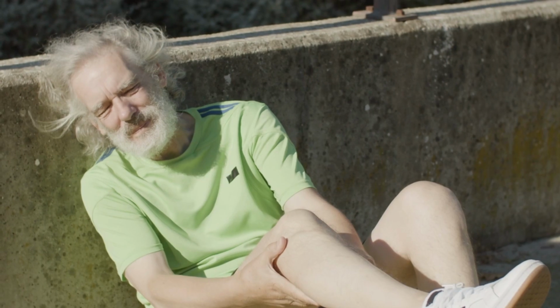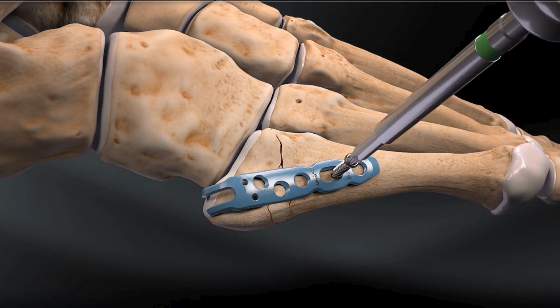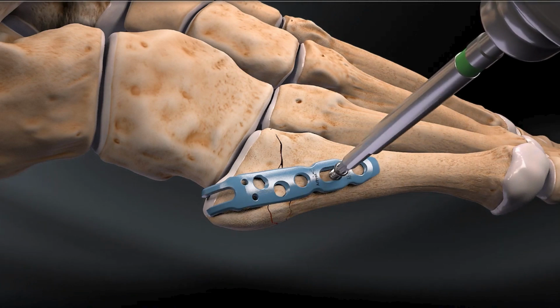Today, I'll brief you about the implants used in orthopedic surgery. We can divide them broadly into three categories. First group are the ones which are used to fix your fractures whenever you suffer a traffic accident or a fall and you break any of your bones. Those are the implants which are used to fix your bone. They are usually plates, screws, or what we call interlocking nails.